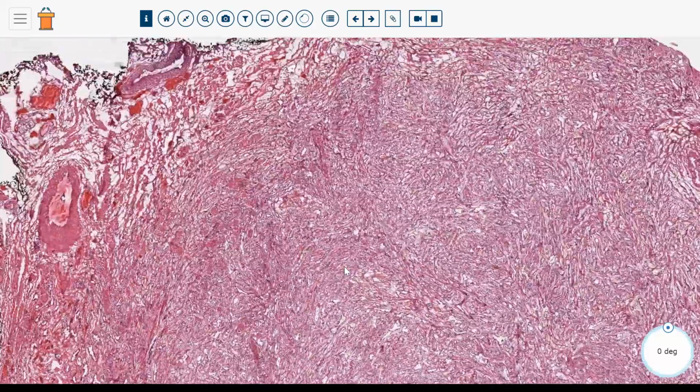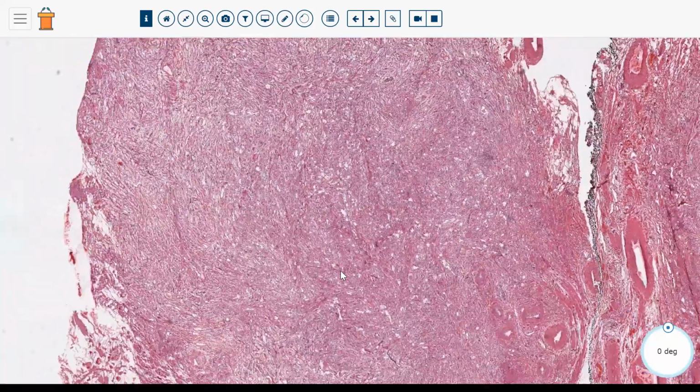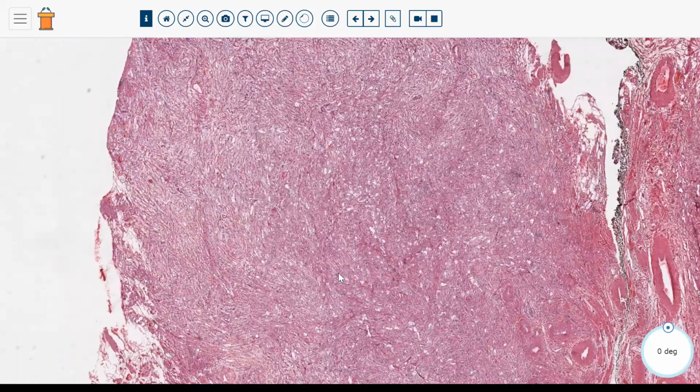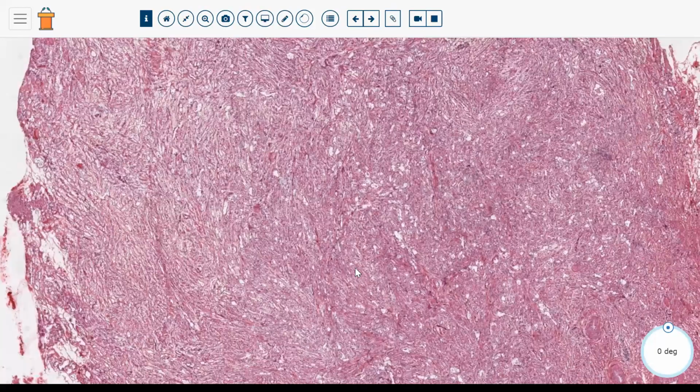And adenomatoid tumor is the most common paratesticular tumor, and so it's very helpful to know about this for frozen section purposes. If your urologist is aware that you have a lesion that's just in the paratestis and not within the testis itself, then they might take a biopsy or an excisional biopsy or an incisional biopsy of this and submit it for frozen section, in which case, if you're able to correctly diagnose it as an adenomatoid tumor, you can spare that patient from having to have a radical orchiectomy where the entire testis is removed. But again, I think this is a good example of adenomatoid tumor.